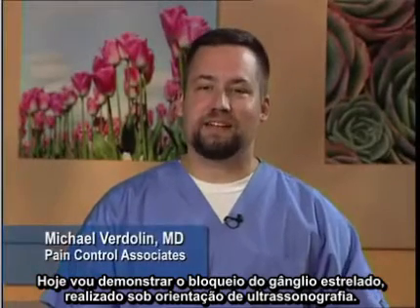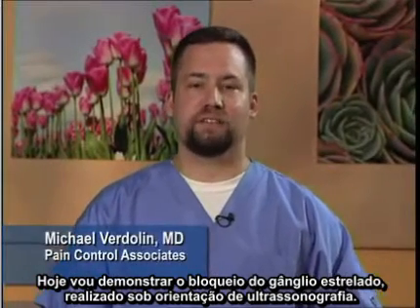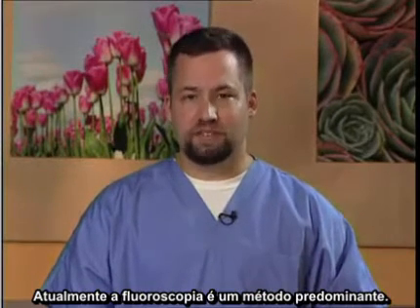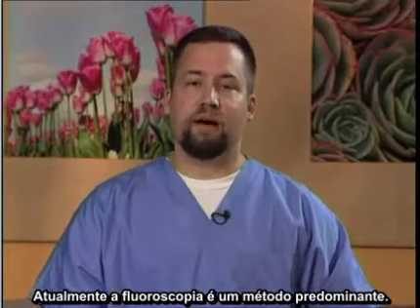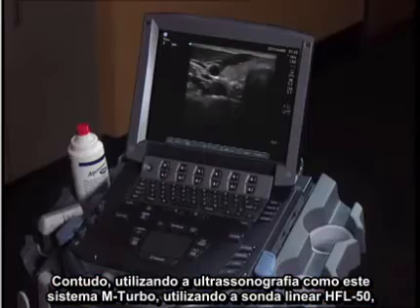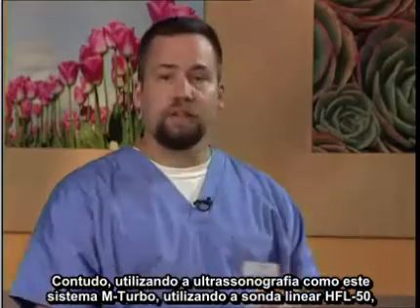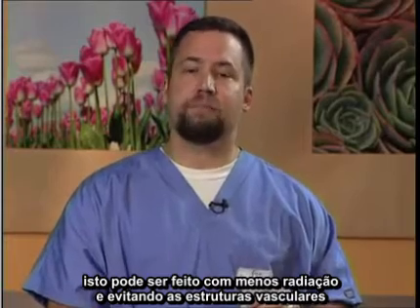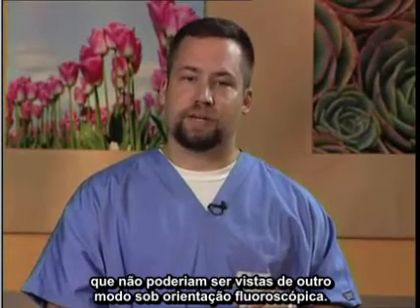Today I'm going to demonstrate the stellate ganglion block performed under ultrasound guidance. Traditionally, this block was performed blindly without the use of any imaging modality. Currently, fluoroscopy is a preferred method. However, utilizing ultrasound — such as this mTurbo system utilizing the HFL50 linear probe — this can be done with less radiation and avoidance of vascular structures that might not otherwise be seen under fluoroscopic guidance.